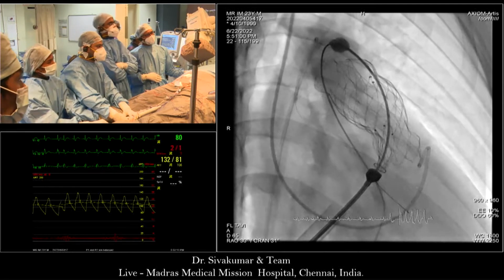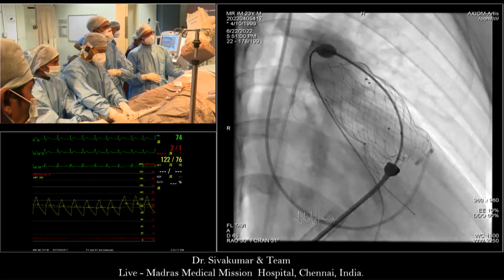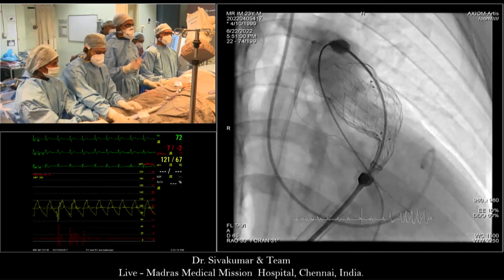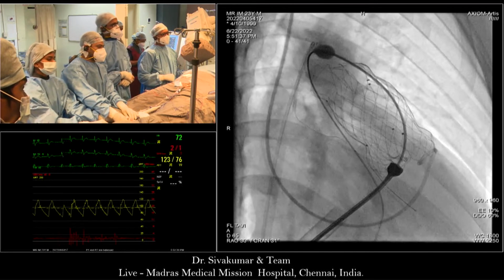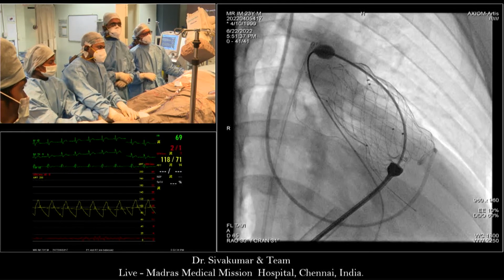Now this is coming now. Yeah. So just watch where your distal flare was originally before you released it and then how it changes a bit. Get ready for another 20 ml angiogram. Ready?